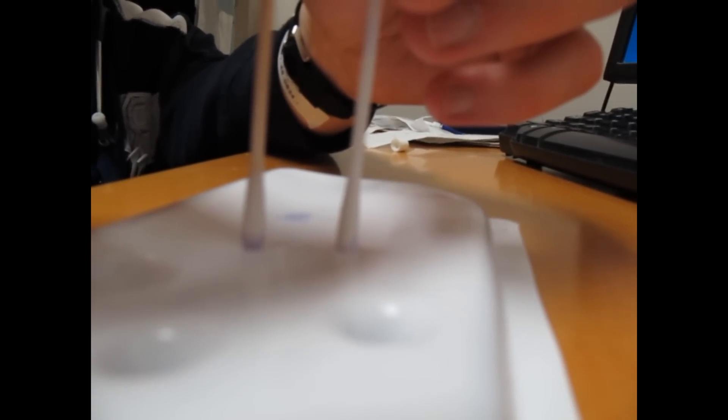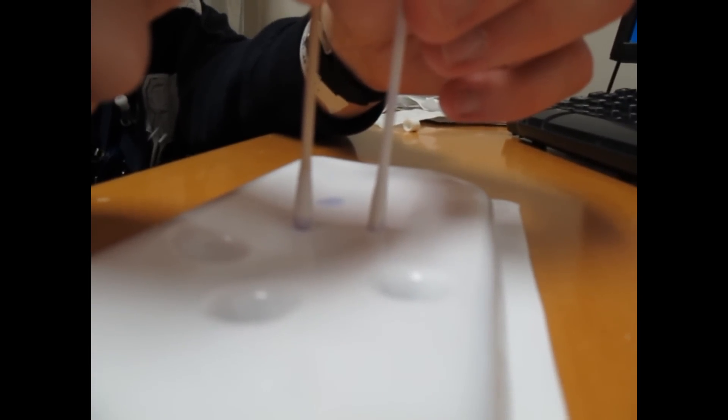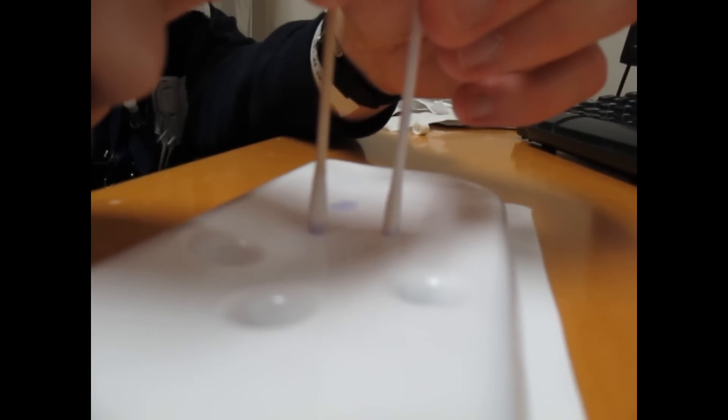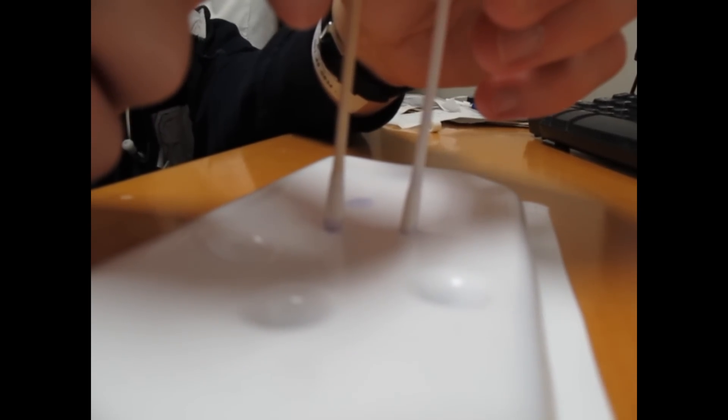Hi Dr. Bell — we're experimenting with the Dermabond, doing a little research project. We've got two swabs: one with a plastic shaft and one with wood, both with Dermabond. We tried the wooden tip and the plastic tip without cotton and it didn't work. Now we're trying it with the cotton to see if that'll work for foreign body removal from an ear. Dr. Bell tried it once and it didn't work either.